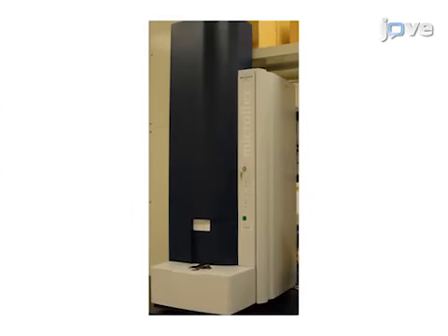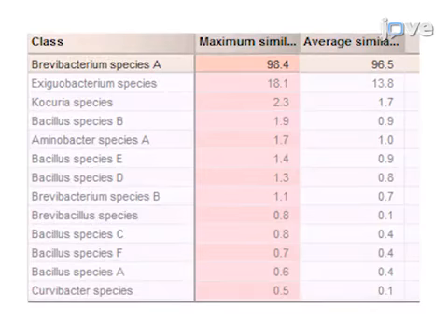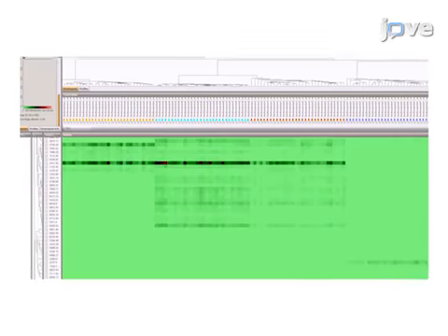analysis. Finally, mass spectra of blind-coded bacteria, which are randomly selected from these 15 bacteria, are collected again and compared to the reference spectra in the model database for identification. Results show that bacteria can be correctly identified either based on similarity coefficients or potential biomarkers and peak classes.